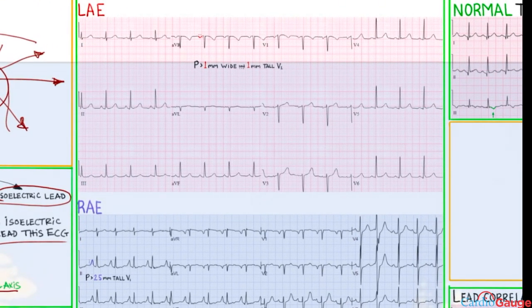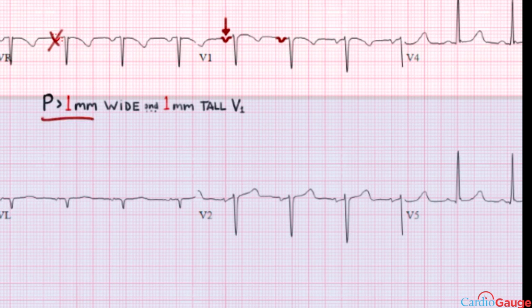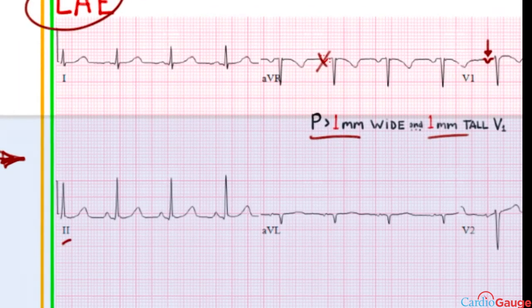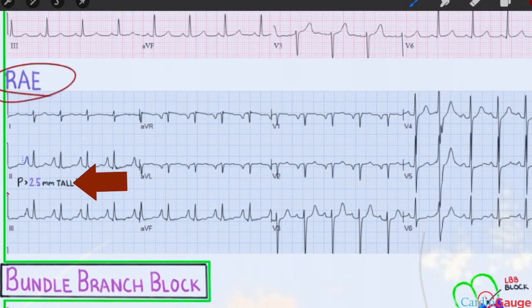Looking at examples: for left atrial enlargement, the negative portion of the P wave in V1 is greater than 1 millimeter wide and greater than 1 millimeter tall — that confirms left atrial enlargement. It may not show the wide P wave criterion in lead 2, but it's an either-or situation, so one criterion is sufficient. For right atrial enlargement, the P wave is greater than 2.5 millimeters tall in lead 2.